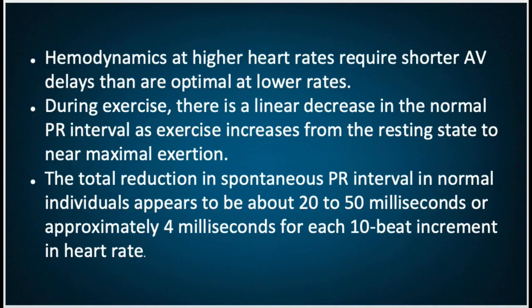Sophisticated pacing systems have already been developed that incorporate these concepts. It appears that cardiac output can be more effectively increased, and pulmonary capillary wedge pressure, presumably an atrial pressure, can be effectively maintained at lower levels using variable AV interval rather than fixed AV intervals.